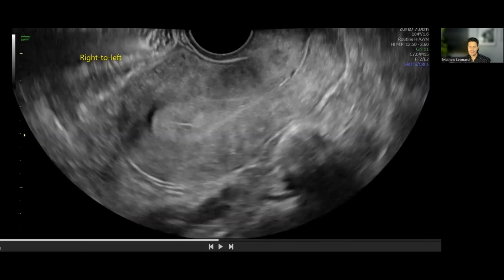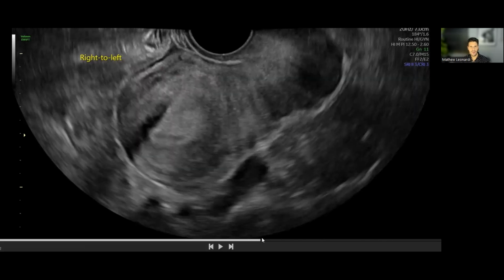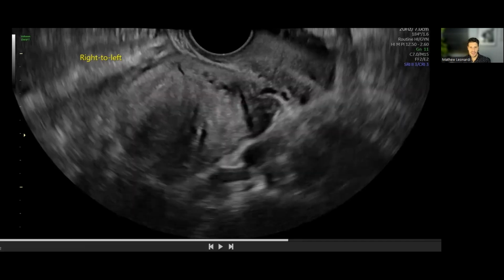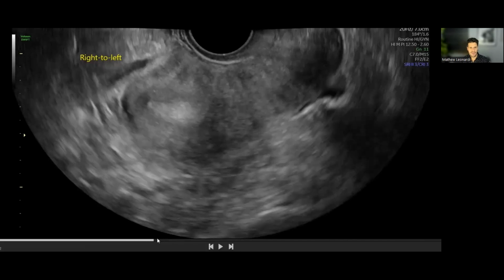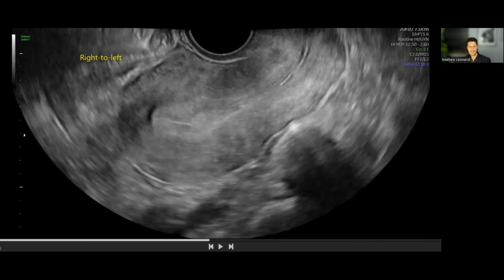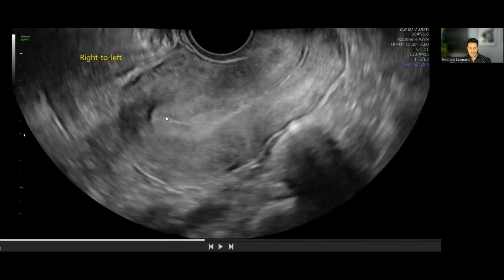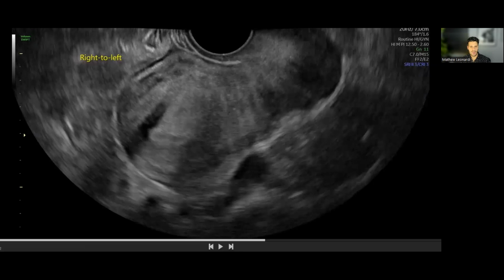What else should we look at in the uterus during this cine loop? We should look for other features of pathology like adenomyosis, fibroids, congenital anomalies even. So as we scan from right to left, if we follow this line, this is one way to assess for congenital anomalies. We can just watch that line essentially come straight through the screen right at us without dipping into the myometrium centrally. So that looks already like a pretty normal contour uterus from a congenital anomaly standpoint.